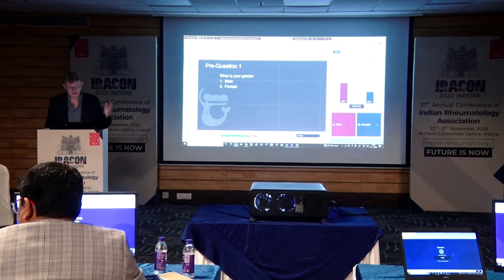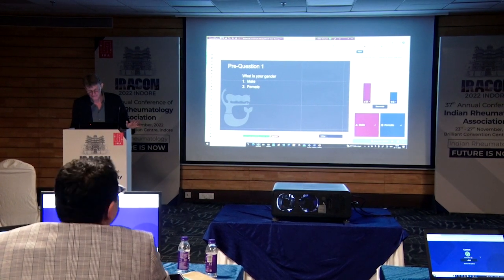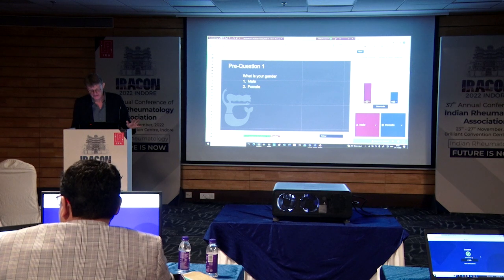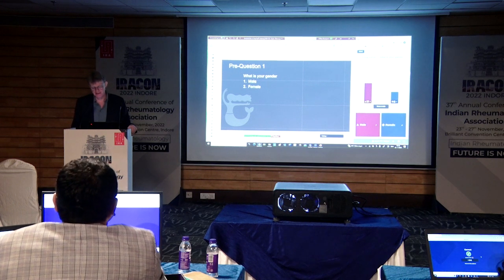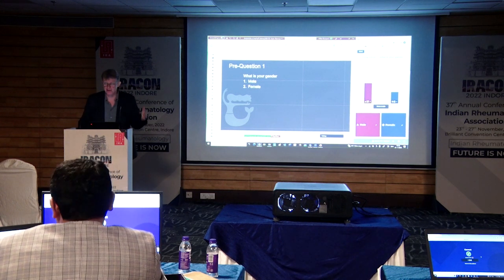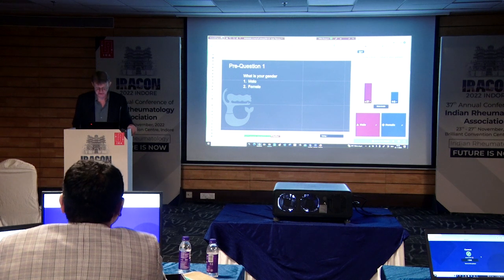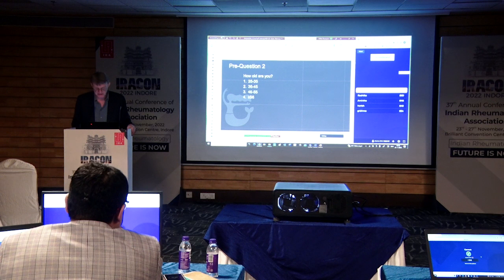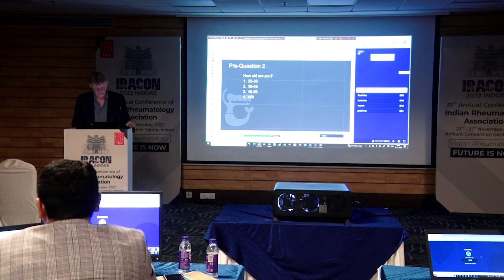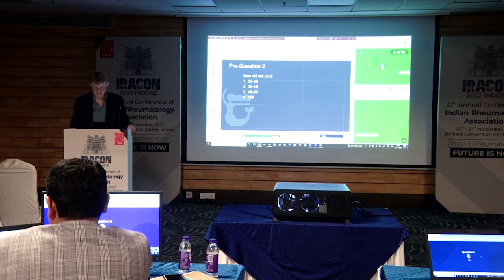Obviously, there's no correct answer here, or all are correct, you could say. But the idea is that when we get to the real questions, you will get points if you answer correctly, and you will also get a few points for answering quickly. But in the end, it doesn't really matter how many points you get. It's just for fun, so that we look at some images. But then you'll see that all answers were correct here. So then the quickest one was the one on the top here. So the next question is this, and again, you can't vote until I push next and the colors come up on your screen, and they'll do that in a second.